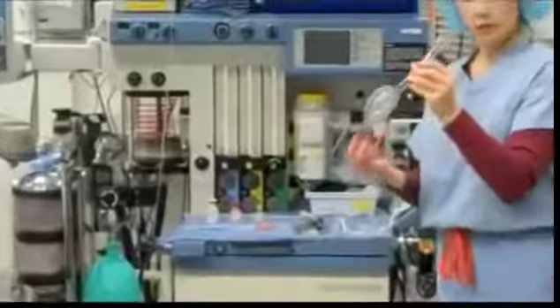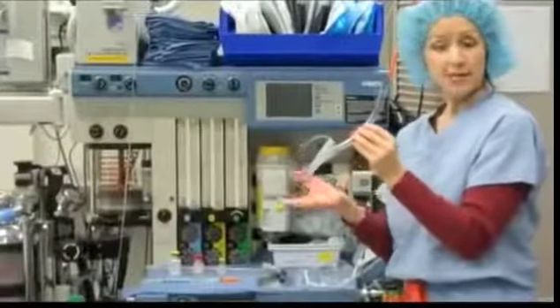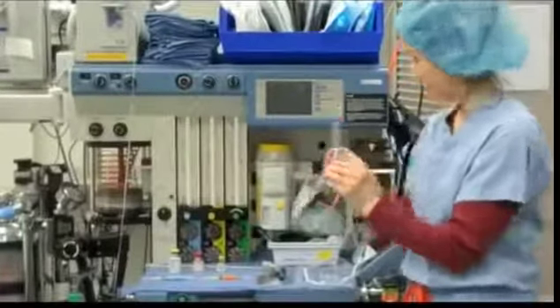This is called a laryngeal mask airway, or LMA. It is placed in the mouth, down, and it sits right above the vocal cords, and it allows the patient to breathe in gas easily in and out through this device.